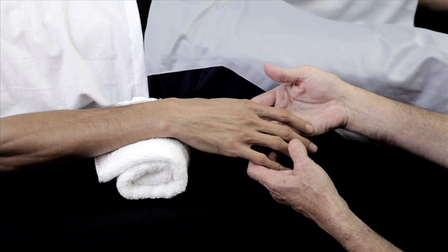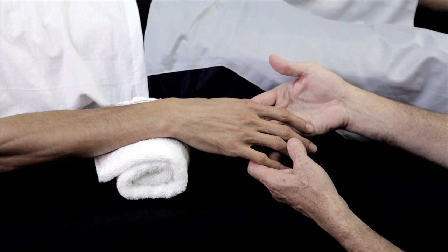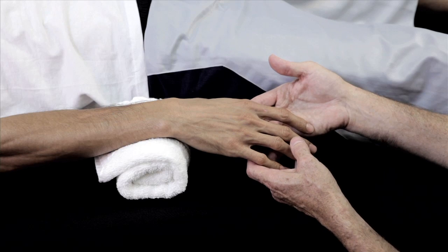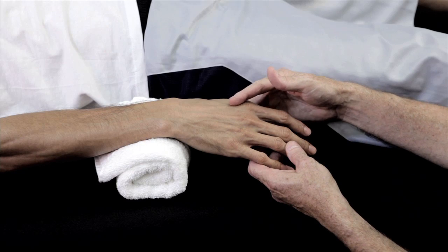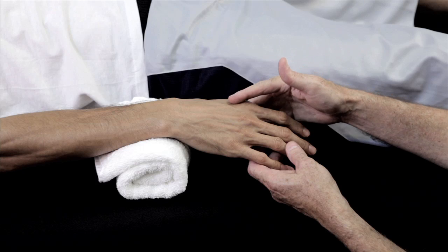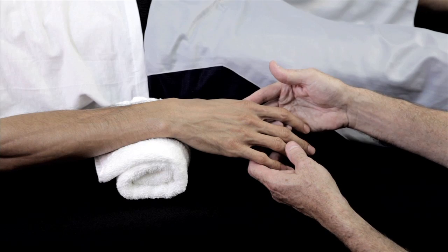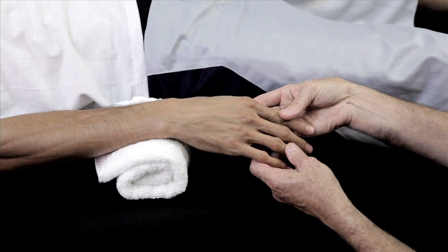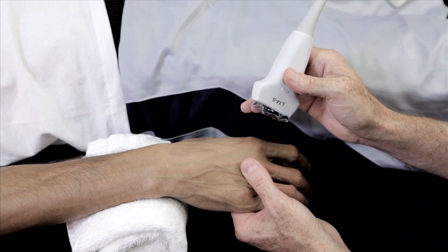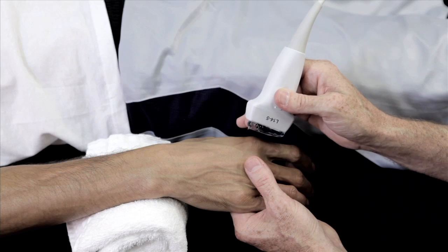One of the most common sites in the hand and wrist to evaluate for erosive disease in arthritic conditions is the dorsal metacarpal phalangeal joint. The patient's hand is pronated to expose the dorsum. We place a longitudinal probe across the joint space to visualize the extensor compartment and joint space. It is also important at times, once the probe is placed, to stabilize the joint from the palmar aspect.